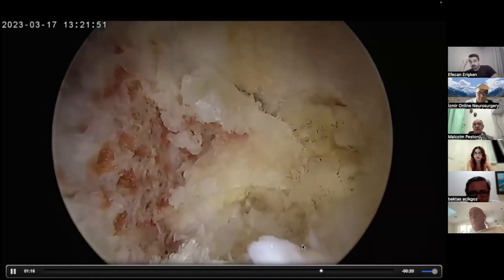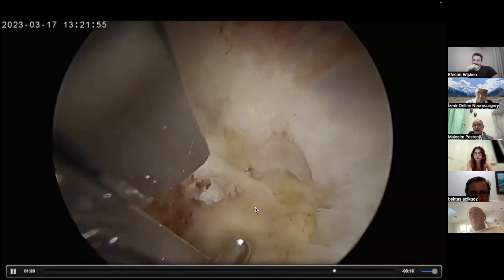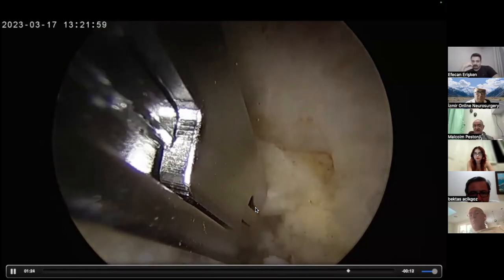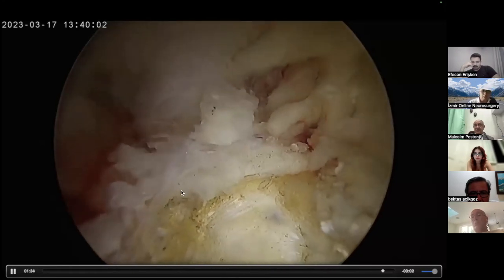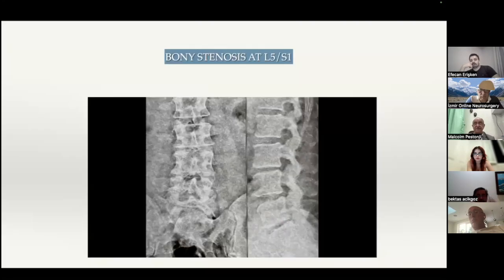So finally, we do further salami slicing, one more piece out, and that appears to be the final piece. Yes. So you can see how deep we have gone. Finally, you can see the hard calcified disc. You can see the axilla and traversing root, a little elevated. We had to do a discectomy, partially again, to decompress this. But it was such a tight and horrible case. We'll talk of this case.